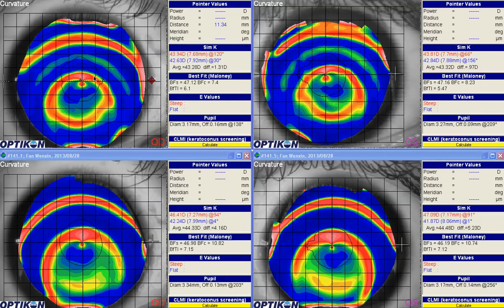That said, I'll just use this video to describe how I currently design my semi-scleral lenses for myopic ortho-K. And it's pretty similar to what some other doctors on the group are doing. In fact, I got most of my tips from those who are a little bit more experienced with large lens designs. And I have found that with patients where the lenses are moving an unusual amount while they're sleeping or centration is difficult, these lenses do work quite well or can work quite well.